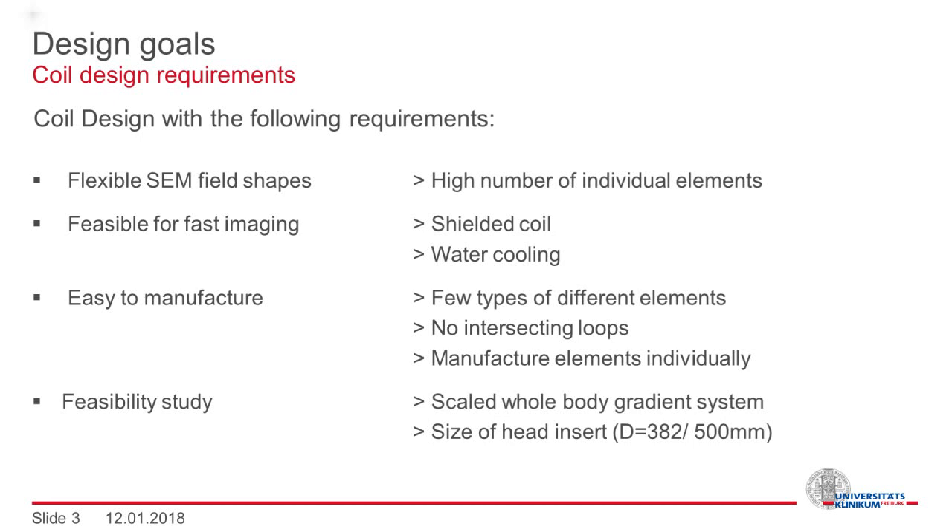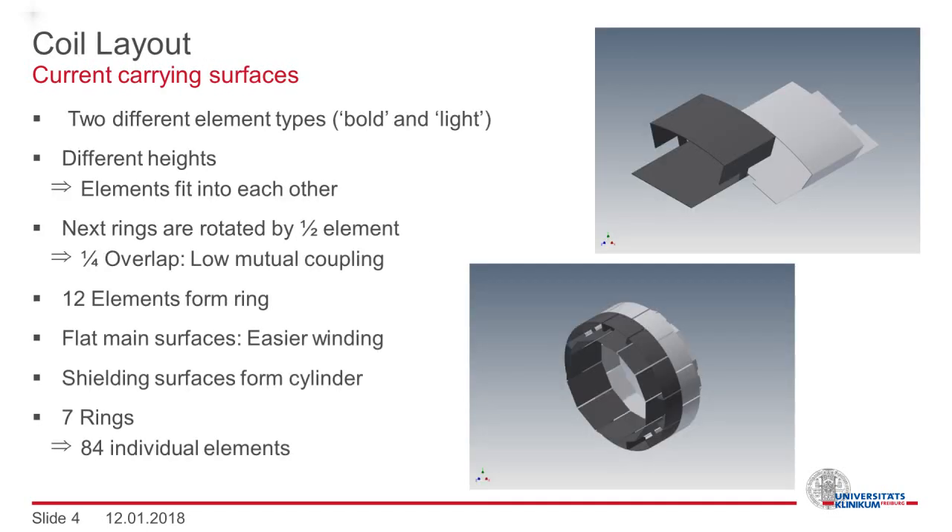Because the whole project is a feasibility study, we chose dimensions of a whole body gradient system and scaled it down to the size of a head insert. The first step to find a coil layout is the definition of current carrying surfaces. Our design consists of two different element types with different heights, arranged in rings which are rotated by half an element. The resulting overlap of the main current carrying surfaces is one quarter of its area, which intrinsically gives low mutual coupling.